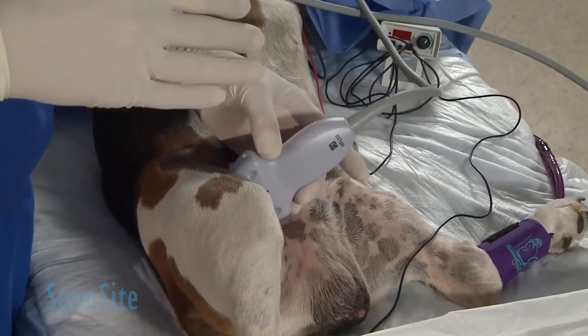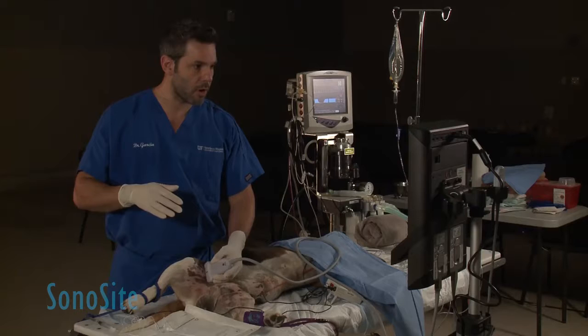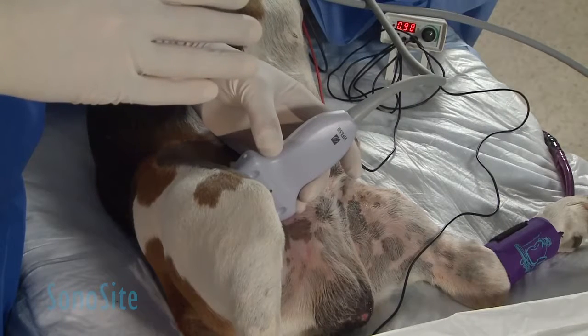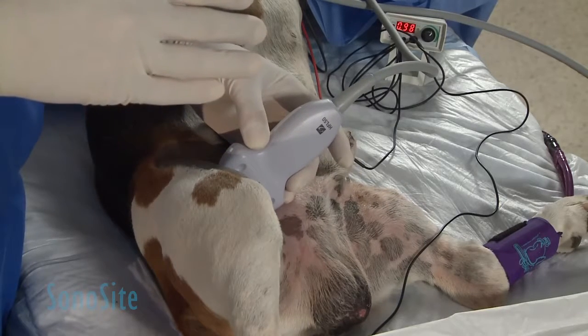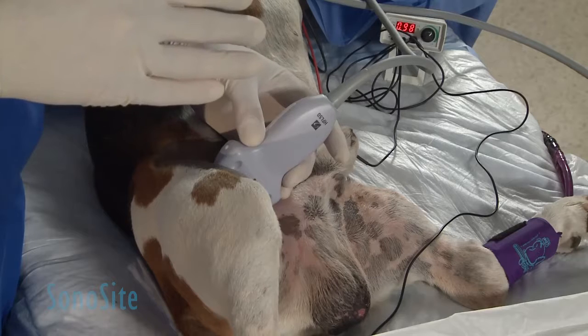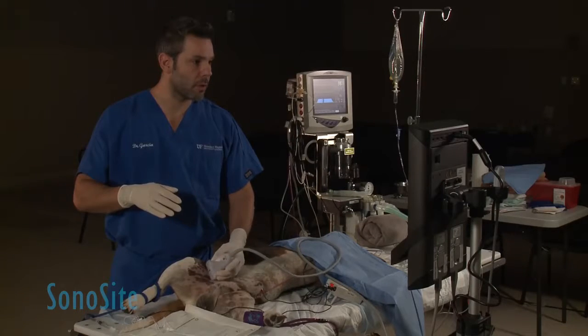I'm going to locate the artery and vein — you can tell if I push a little harder on my probe, I can collapse my vein and identify which one is the vein and which is the artery. Then I'm going to keep coming proximally to the limb.